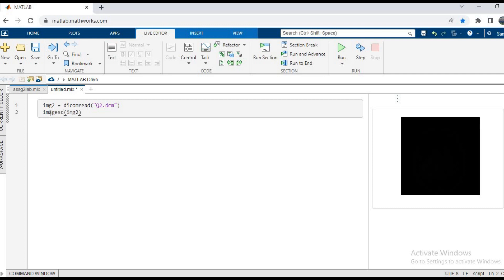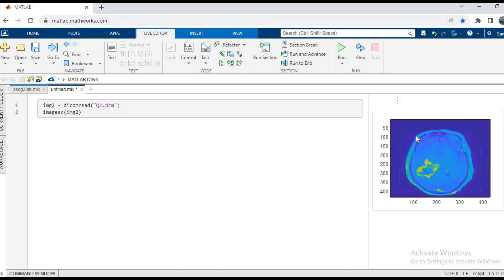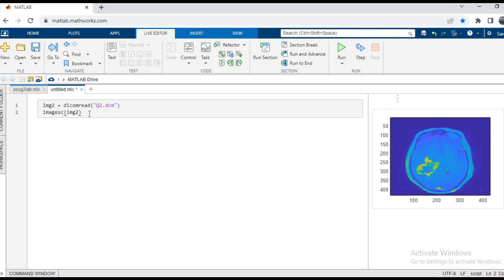To imagesc, and rest is the same. Press Ctrl Enter, and now we can see that the image has been displayed on the output. Now coming to the main thing, we want to see what is the info about this image. So for example, the patient details, the machine details.